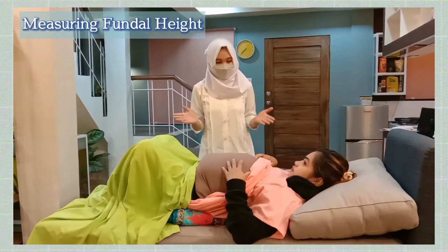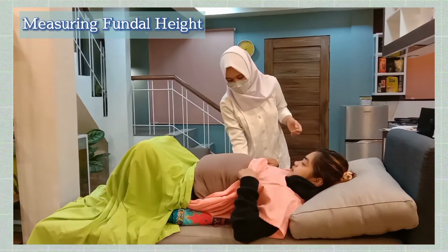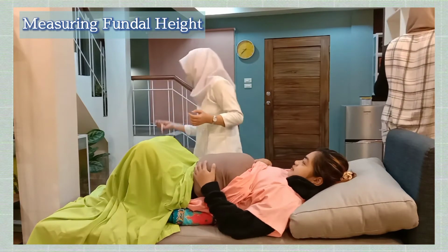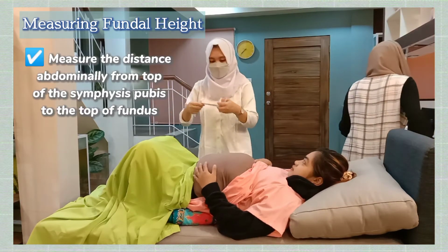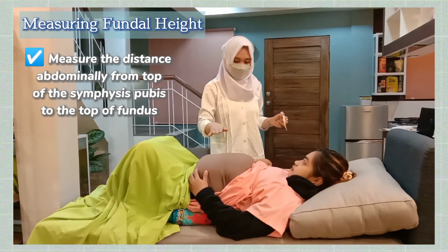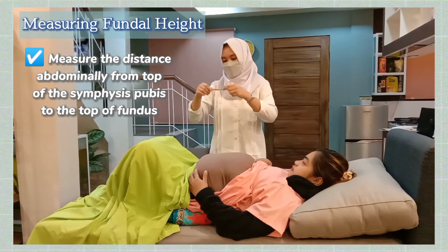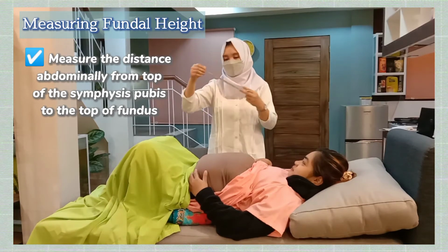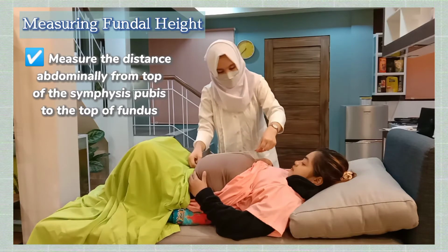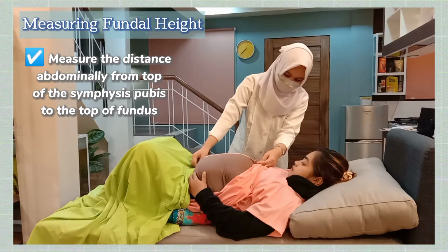Now, ma'am, I'll first start measuring your fundal height. Let me get the tape measure. I will be measuring from the top of the symphysis pubis over the abdominal curve to the top of your uterine fundus. Your fundal height po, ma'am, is 24 centimeters.